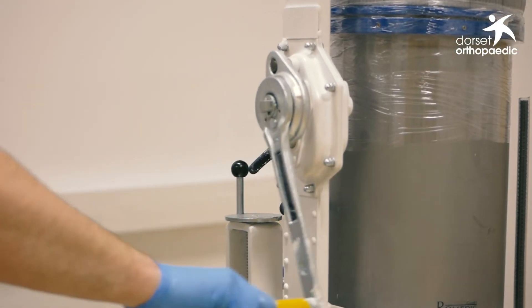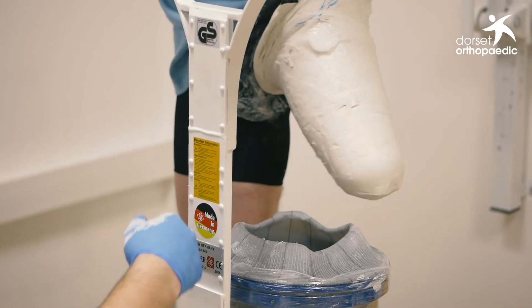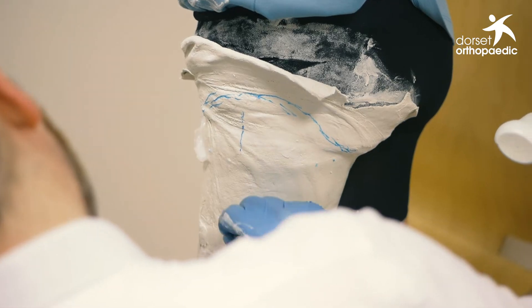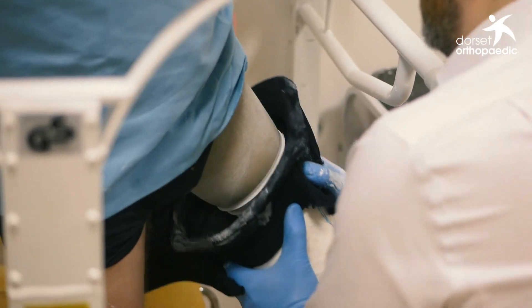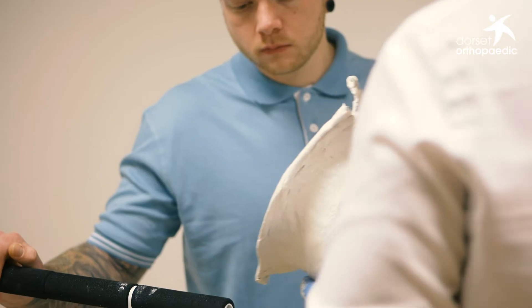The casting cylinder drops down and allows the patient to remove the leg comfortably from the cylinder. We then mark up the alignment lines on the cast to enable us to accurately set up the socket on their prosthesis, and then remove the cast from the patient's leg and take it through to commence the cast rectification process.